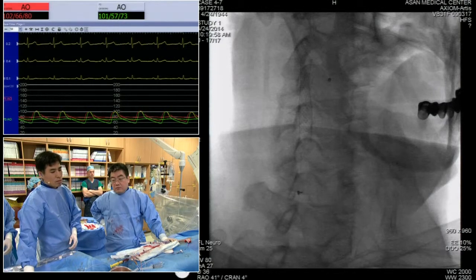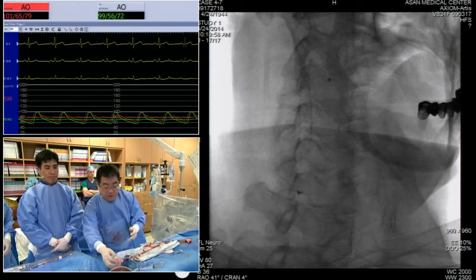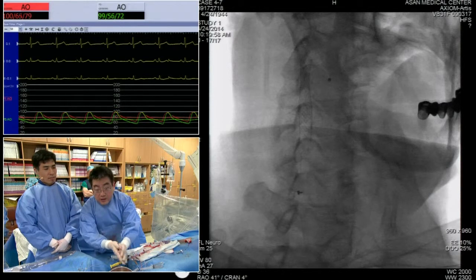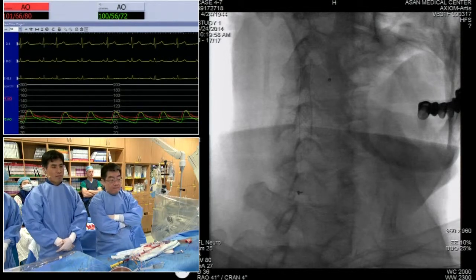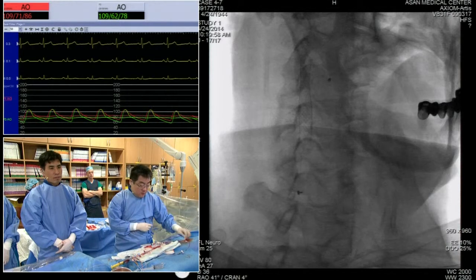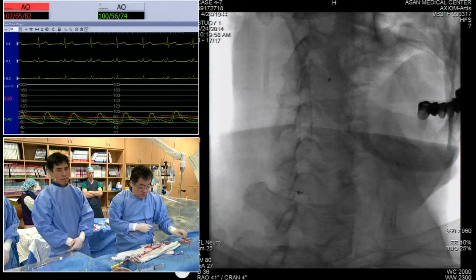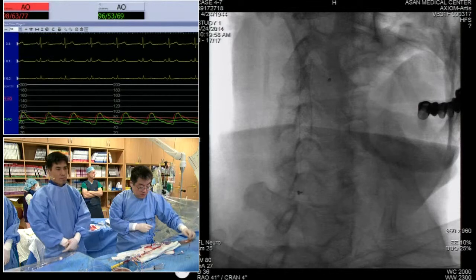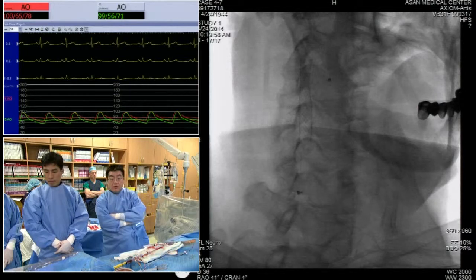But in that situation, I have a question: as an interventionist from a cardiology background, should we be trained to do something intracranially? Yes, that's right, for some neurovascular salvage procedures. This comes up quite often. I'd love to get the panel's thoughts, but the risk of a large embolus in the M1 or M2 territory that you can actually go after is very low. Almost always it's a distal embolic event in the M3, M4 territory where you're not going to intervene anyway. I can't remember the last time we had an embolic event with carotid stenting that would be retrievable.